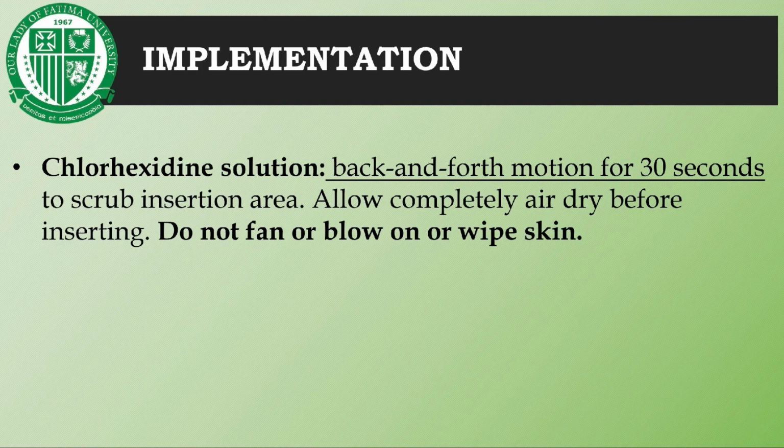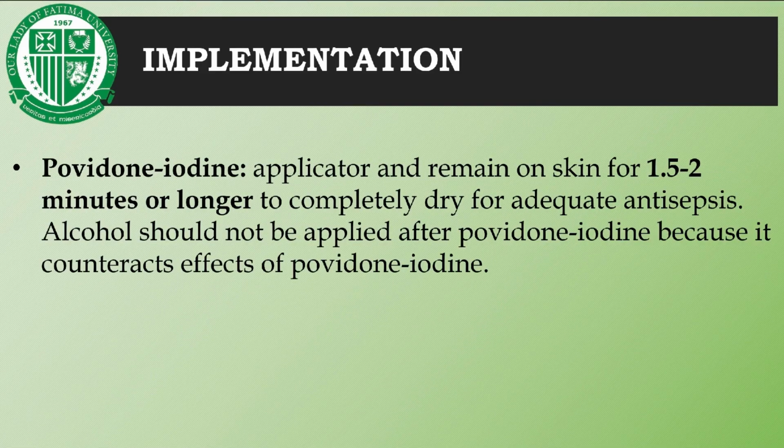Note: do not fan or blow on or wipe the skin, because this action can contaminate the clean area, compromise the sterility, and introduce bacteria. Povidone iodine, used with an appropriate applicator, should remain on skin for 1.5 to 2 minutes, or longer to completely dry for adequate antisepsis and effective microbial reduction.